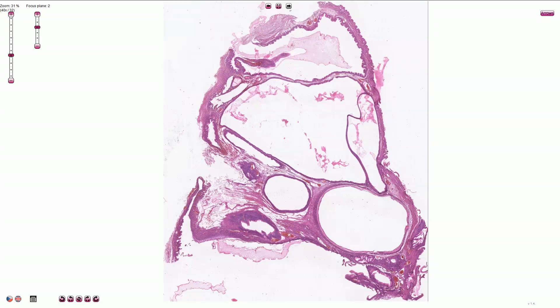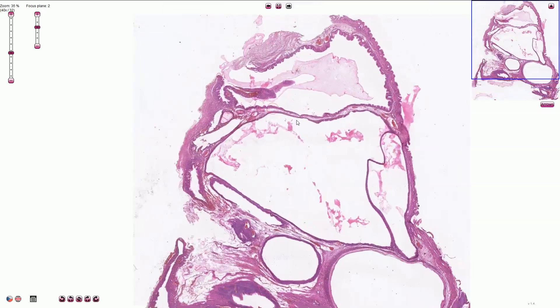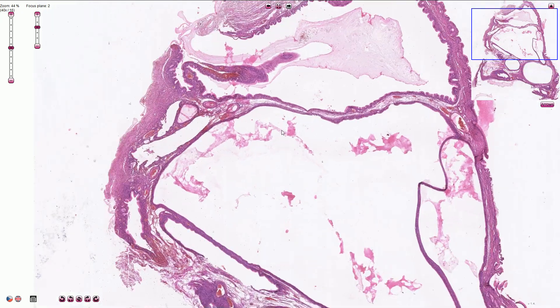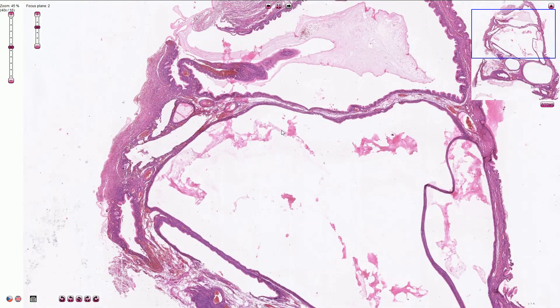Here we have another cystic ovarian tumor. It is composed of large cysts with only a small amount of stroma in between them. For the diagnosis it is important to look at the epithelium which lines the cystic structures.